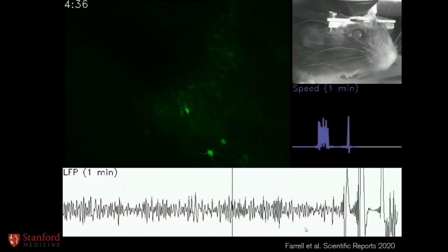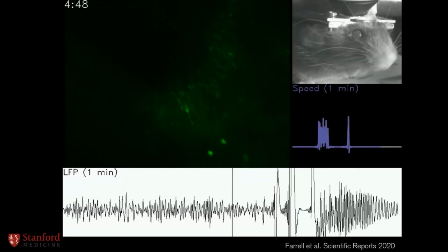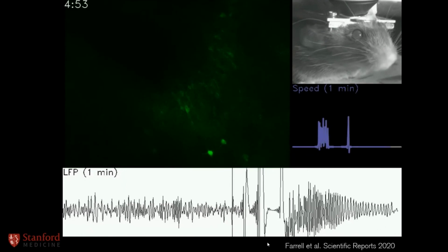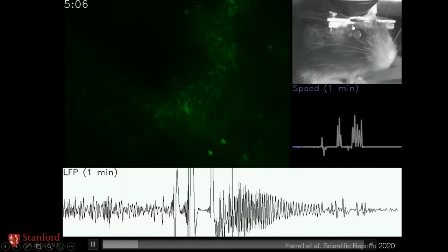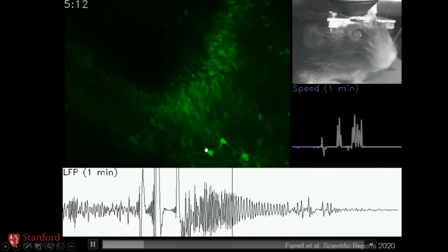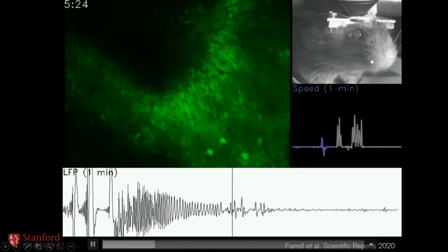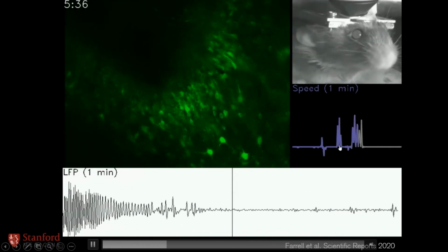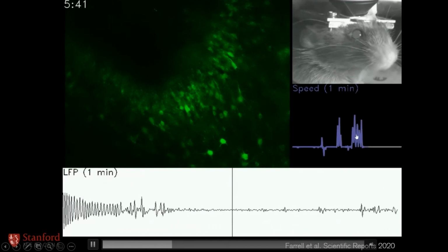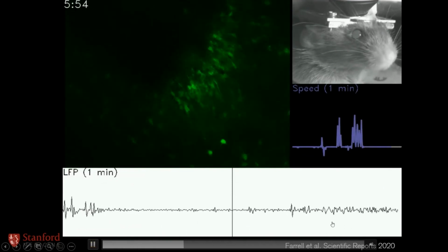So I'm going to put together a bunch of these concepts in an experiment by one of my collaborators, Jordan Farrell. Here he has the animal head mounted. He's doing confocal imaging of the animal's brain, and this is an epileptic animal. Here you can see him actually having a seizure. He's got these mouth twitches and whisker twitches. And he's also recording the speed at which the animal runs on this ball while doing a local field potential.